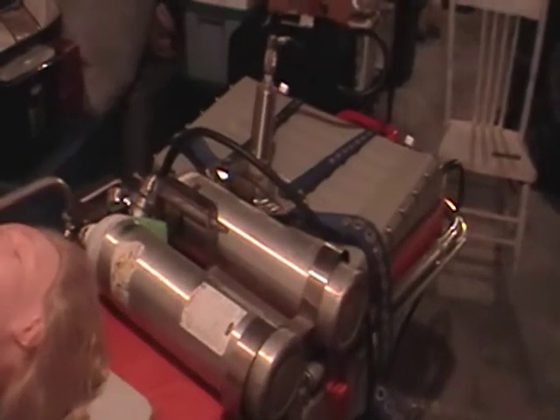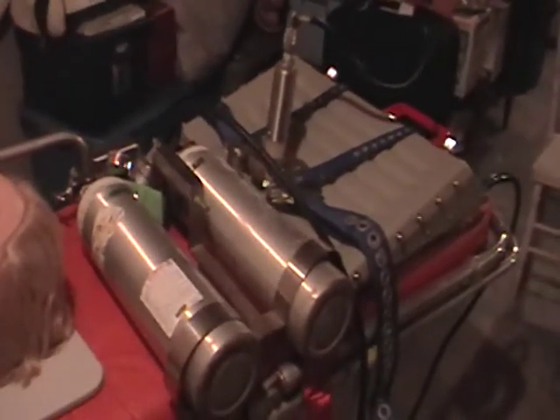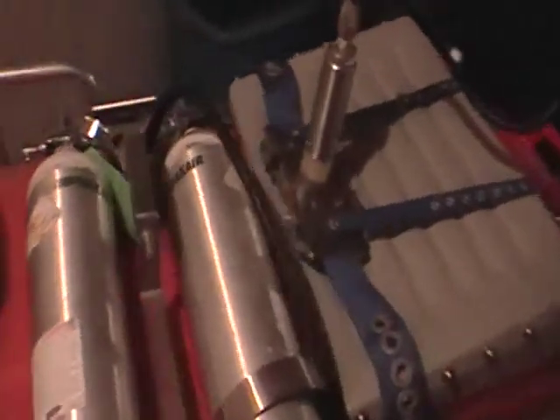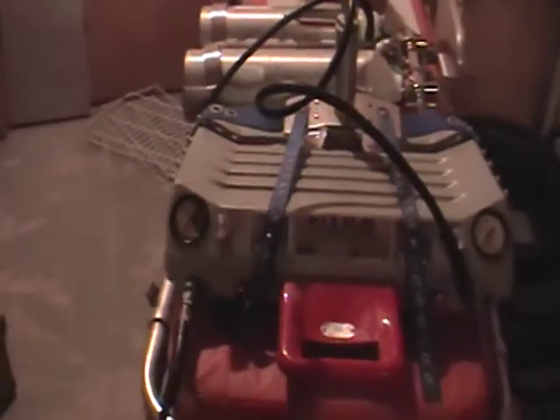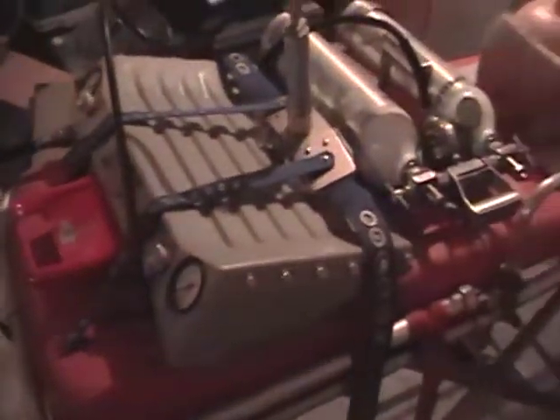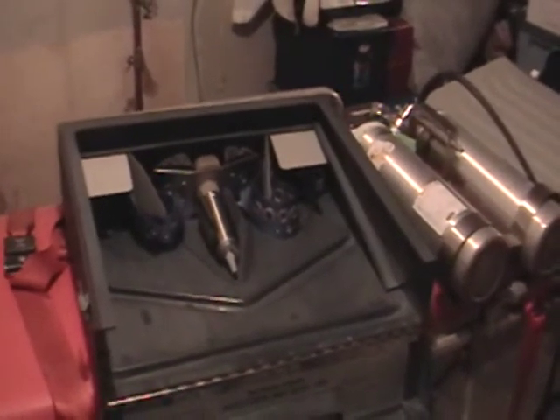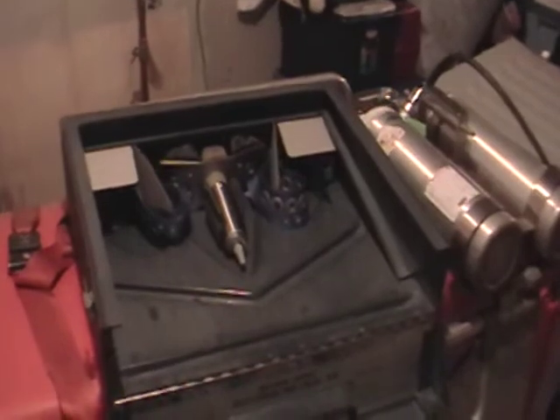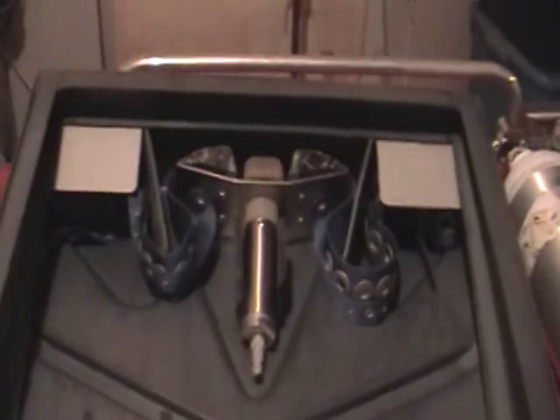So here it is folks — your state-of-the-art Brunswick HLR. HLR stands for Heart Lung Resuscitator. It will be interesting to see your comments online if you've used this machine or something similar. The HLR came complete with a case to provide compact storage of the equipment.